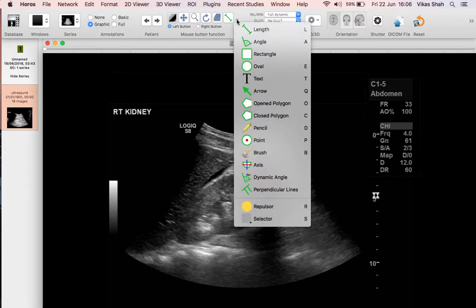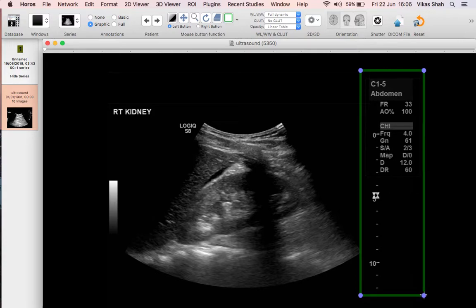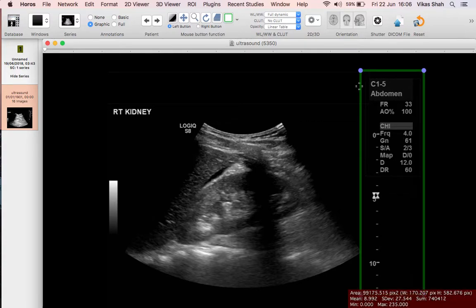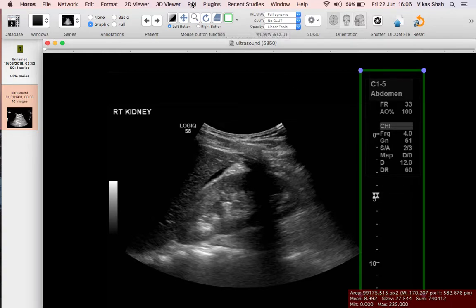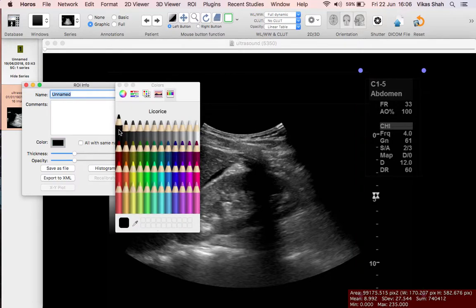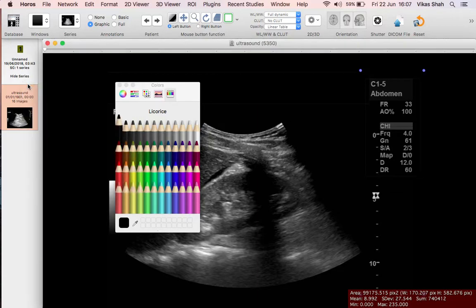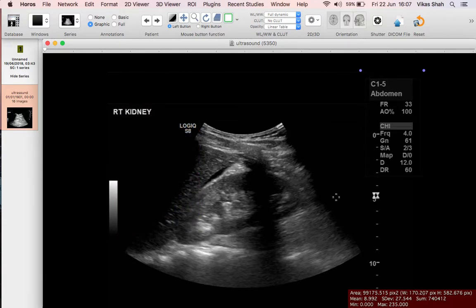Click on this arrow here which brings up the ROI menu and select the rectangle ROI — that's the one most appropriate for this set of information. Drag the ROI over this region and you can see it brings up the ROI box with a thick green line. We don't want that green line visible on the images, so go to ROI in the menu bar, select ROI info, and change the color to black so it blends in with the background, and change the thickness to zero. Now you can see we can't actually see the ROI at all.